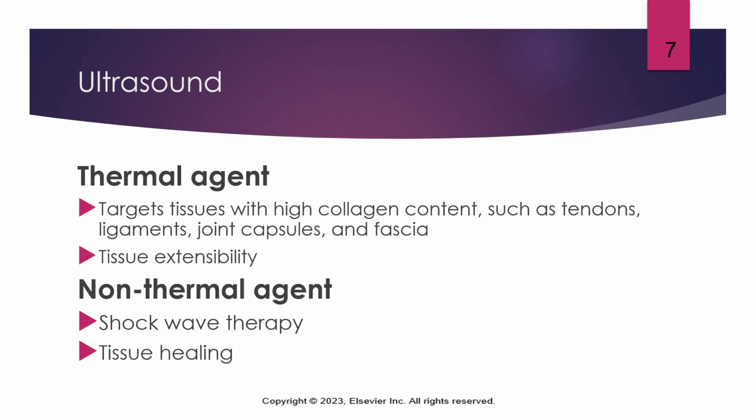Then we get into non-thermal agents. We're not going to talk a lot about shockwave therapy. It's something that you'll see, I think, rarely in clinic. There's a few clinics around town here that do use shockwave therapy, but it's not considered to be one of the most common uses of something like sound therapy. But we are going to use non-thermal settings for ultrasound to invoke more of these different types of tissue healing. So we're going to, again, talk about all of these different forms or these physiologic responses that induce tissue healing, like cavitation, microstreaming, and those kind of things.